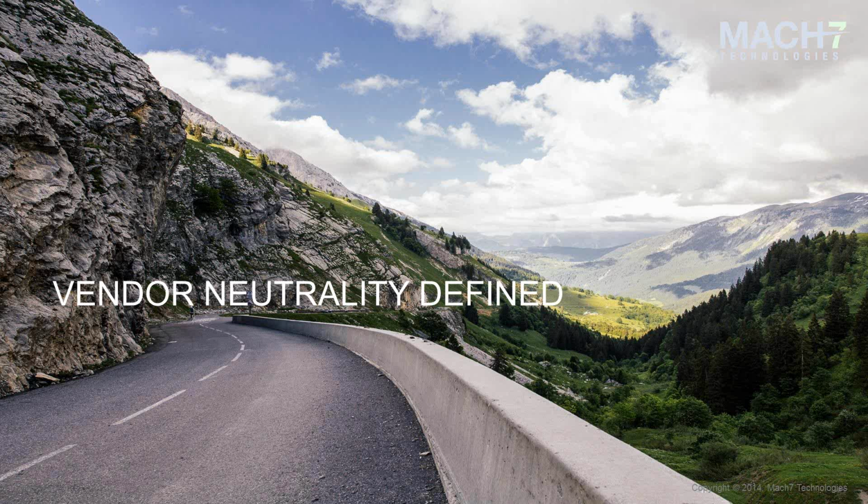I think I'll help to define that a little bit in the next slide. I think that's a good question, though, and there are certainly flavors of it today. At a high level, individuals would term a vendor-neutral archive as an archive that's storing data in a standards-based format. It has capabilities to store across many different types of storage devices and it has a flavor of storage management to it.